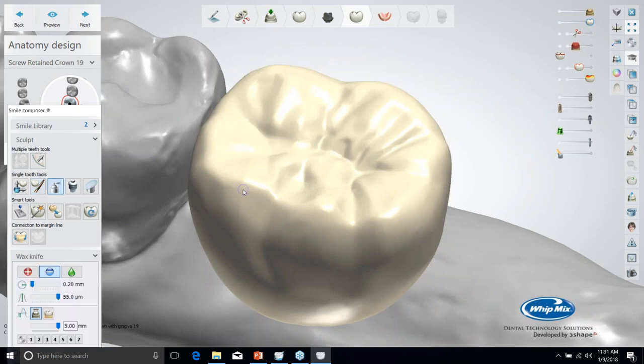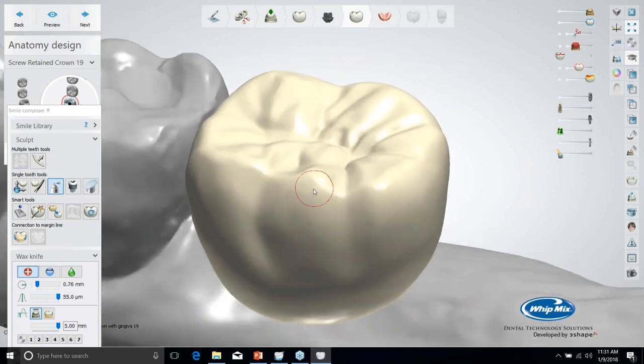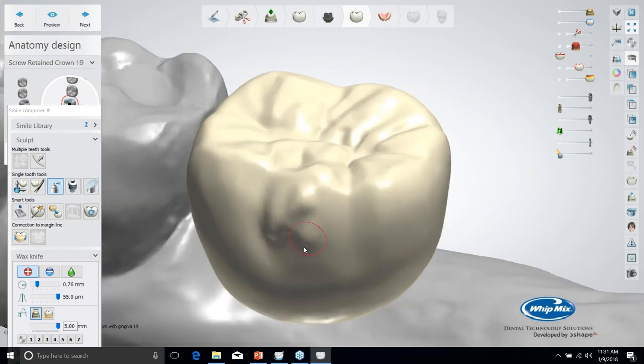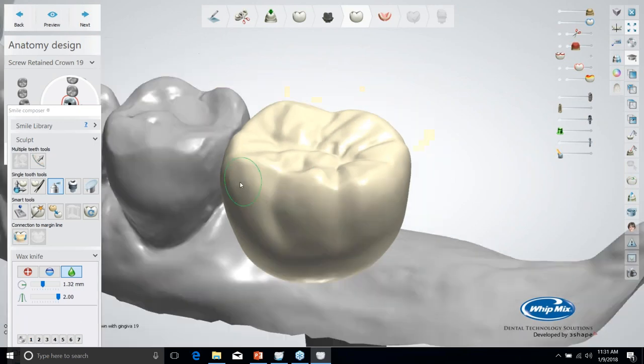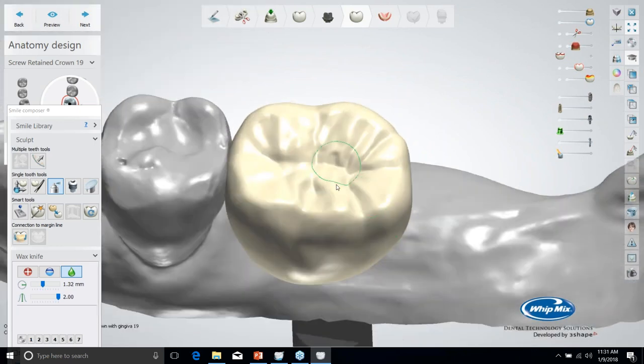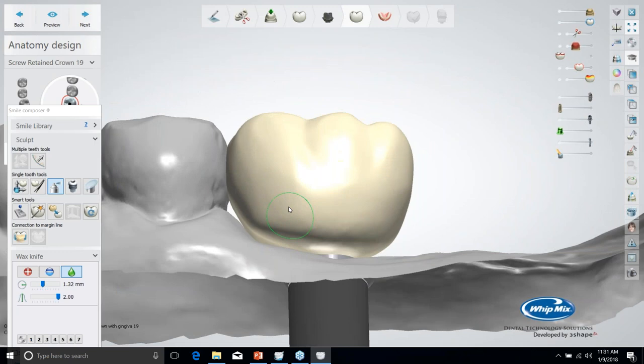The next one over is the wax knife, and this essentially would be the closest tool to adding or removing wax in an analog method. So the plus allows me to sculpt and add material, and the minus will remove if you don't have a threshold tool on. So now I can remove, and then the green smooths. Generally, once I have my design the way I want it, I'm only using the wax knife to carve anatomy, or once we put the tissue on, smoothing up the junction between them.